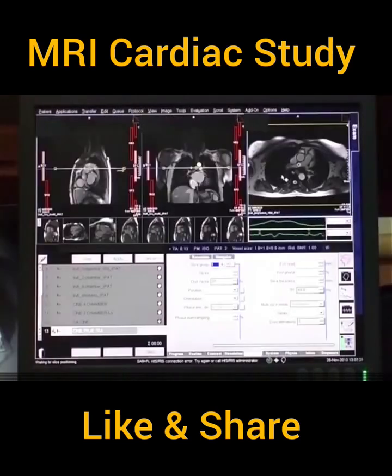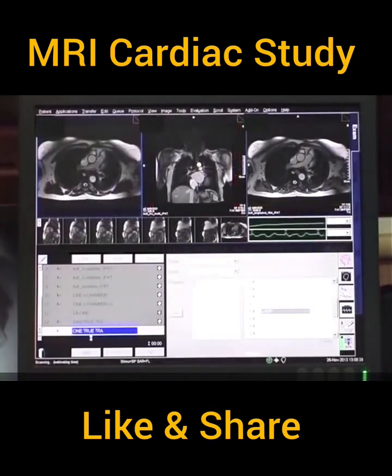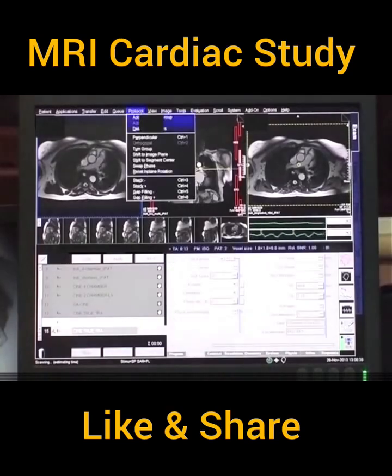True axial cine images are taken from the base of the heart to the apex in all patients suspected with ARVD. This is because the RV free wall is best seen in this sequence as compared to other sequences of the heart.